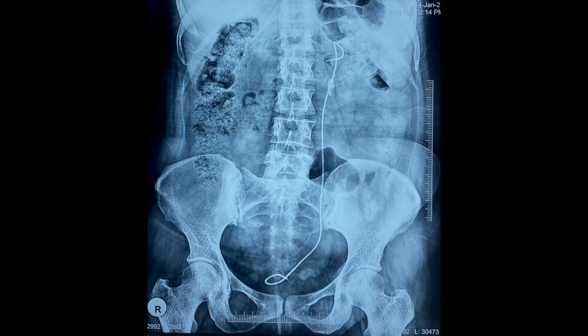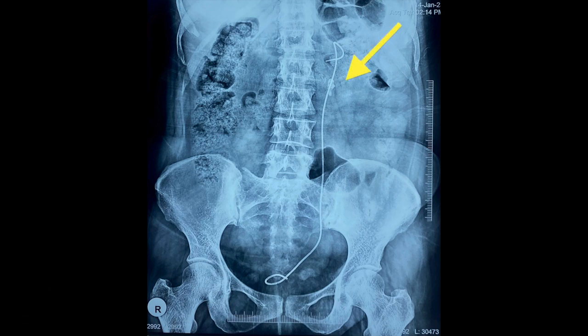This is a young patient who is having a left upper ureteric stone of around 2.3 cm in size, and the patient is already on a left sided stent. In view of the large size of the stone, we have planned for left sided mini PCNL in this case.